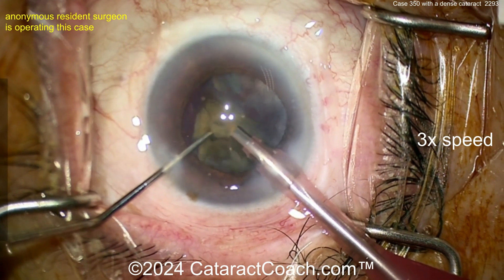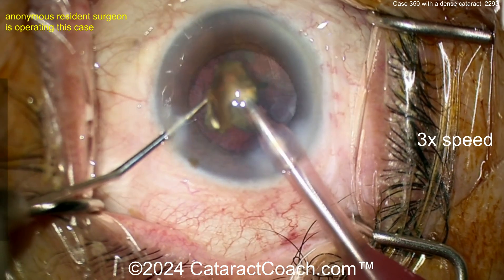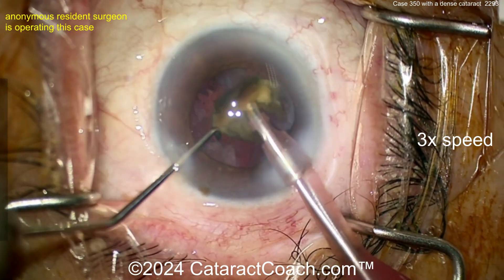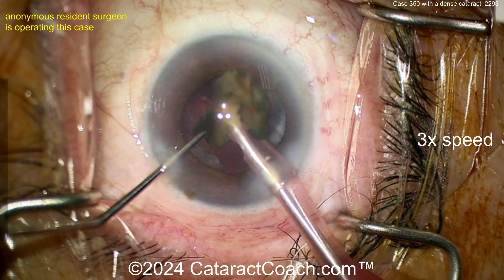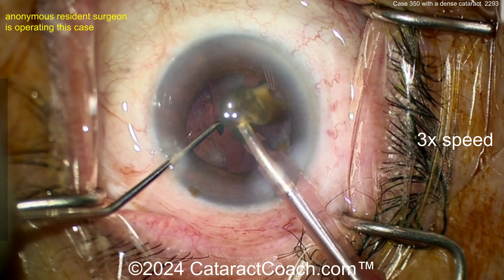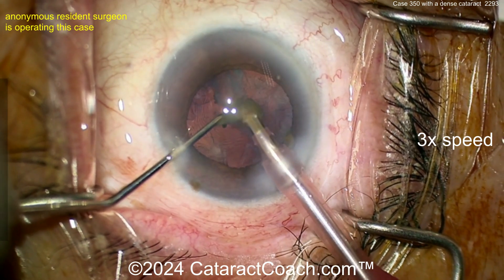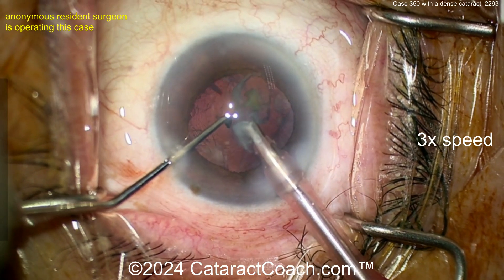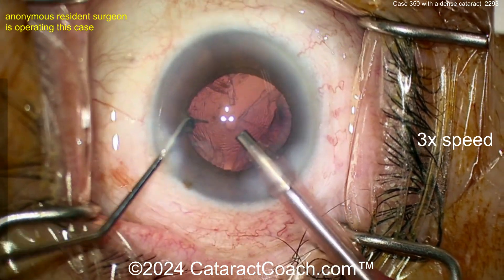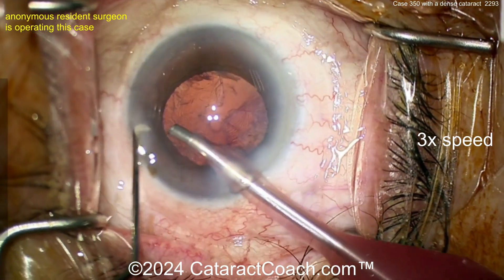I like the pivoting in the incision — there's no phaco wound burn here, that's a great thing. You can also recoat the endothelium if you need to. In these dense cataract cases, you're putting in more and more phaco energy — watch your machine, look at the cumulative dissipated energy or delivered energy. If it's very high, you may want to stop periodically and recoat the cornea with viscoelastic to protect the endothelium. Look at that — cleaned up beautifully.